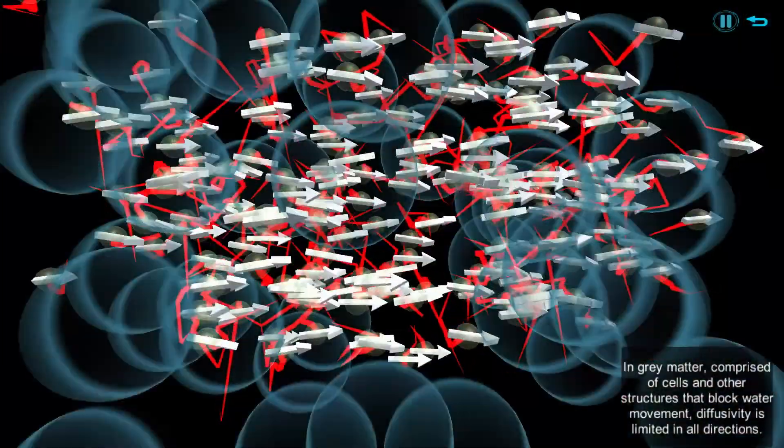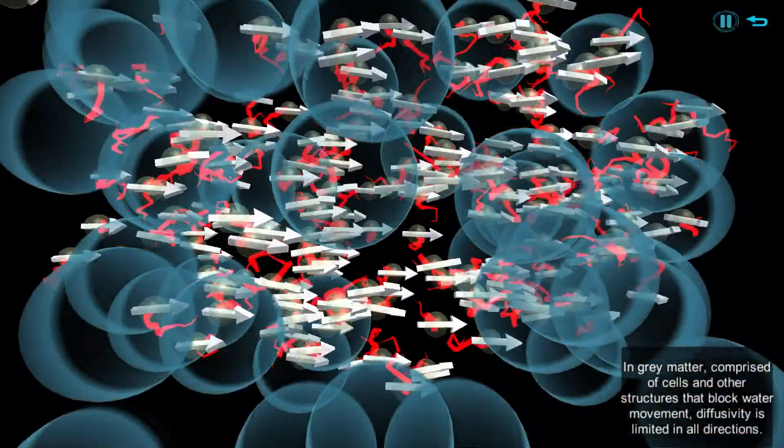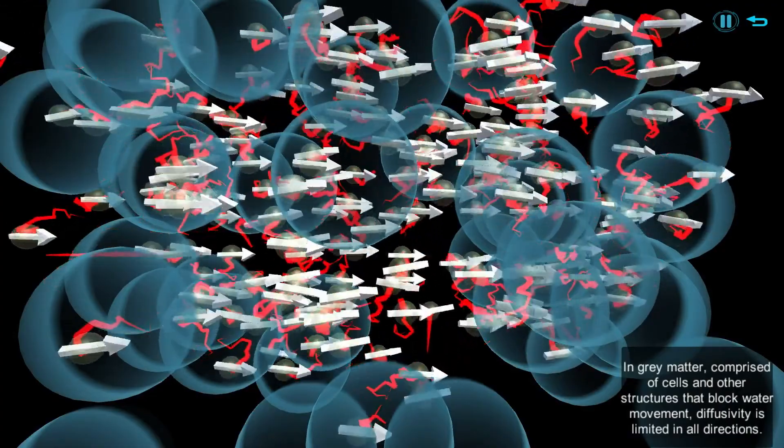In gray matter, comprised of cells and other structures that block water movement, diffusivity is limited in all directions.